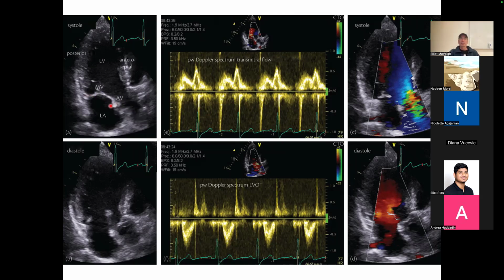So what we can do is we can measure the Doppler spectrum for a specific line. If I look at my whole image, I can draw a line along one place. So I'm going to draw this line right down here and ask, what is the velocity as a function of time? Just on that single beam, and we can map that time domain signal out, right?